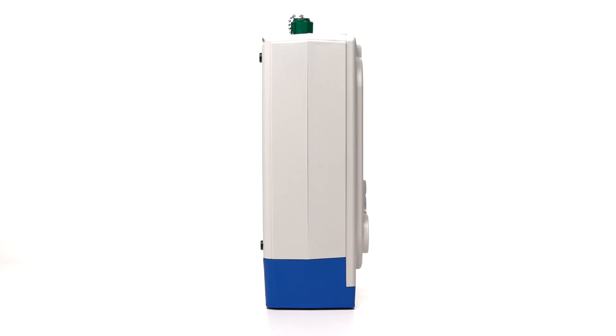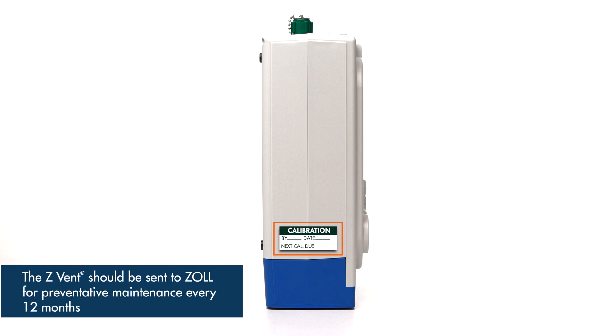Now we will look at the right side of the device. This is where the service and calibration information is located. This label provides the date of the device's last calibration and when the next service is due. The Z-VENT's calibration is checked as part of the annual service procedure. The Z-VENT should be sent to Zoll for preventative maintenance every 12 months or if the device is ever not functioning properly.